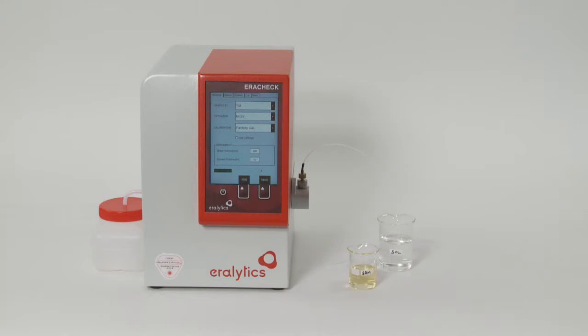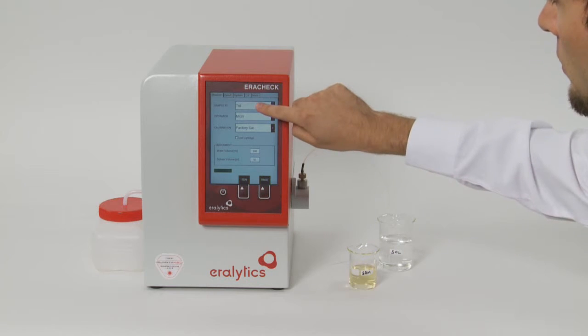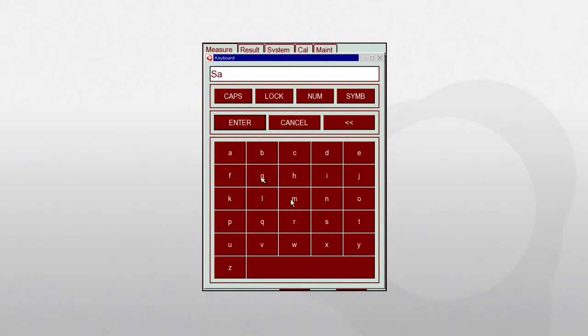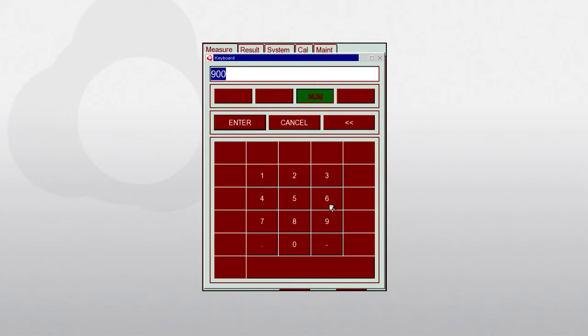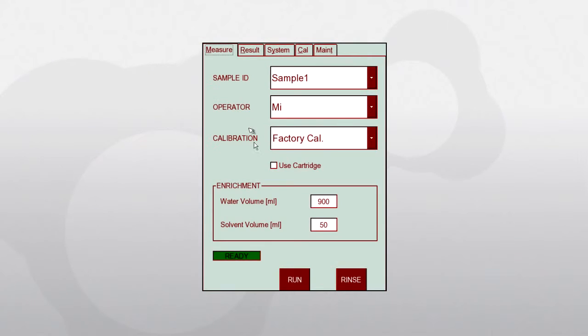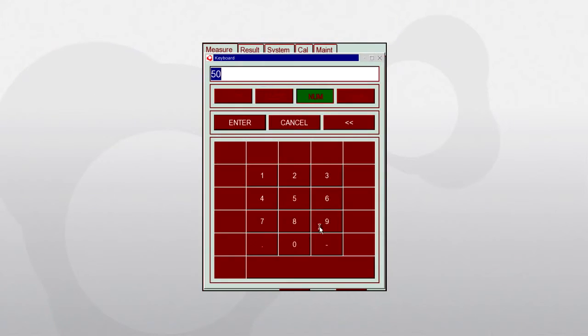Enter the sample ID and the operator on the pop-up keyboard, or select them from the drop-down list of previously entered names. Then enter the exact values for the water volume and solvent volume used for the extraction. We recommend using 900 millilitres water volume and 50 millilitres solvent volume.